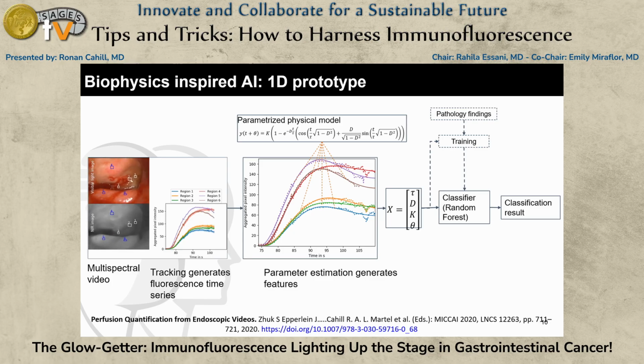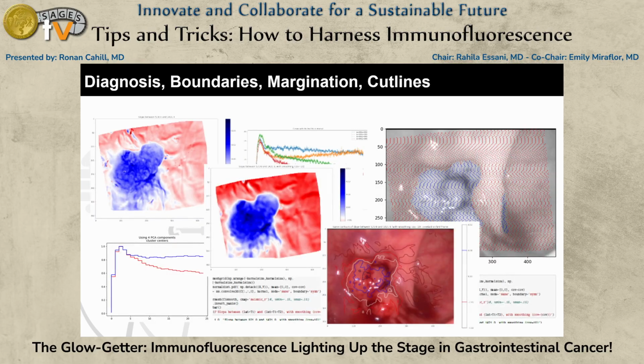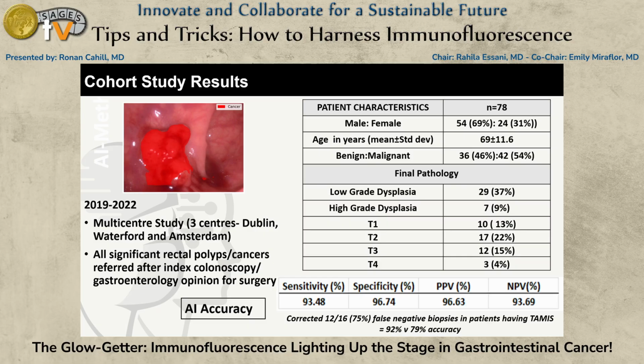That gives you the graphs, but importantly, you want to make some interpretations of those graphs. You want to classify the differences of the graphs. There's lots of significant differences between them. Basically, the tumor is slower to perfuse than the normal tissue. But we are looking at milestone differences along those graphs. Not just is it cancer or not cancer, but you can start to draw boundary maps of the lesion as well. When you're doing local excision of rectal cancers, there's about a 20% positive margin rate, and so delineation of the lesions is also possible using this way. I mean, we think it's possible.